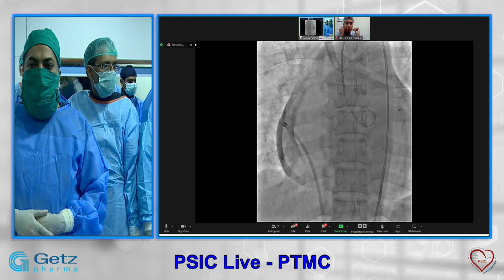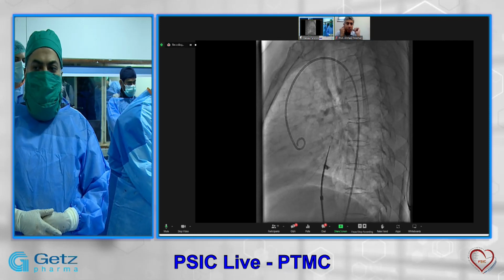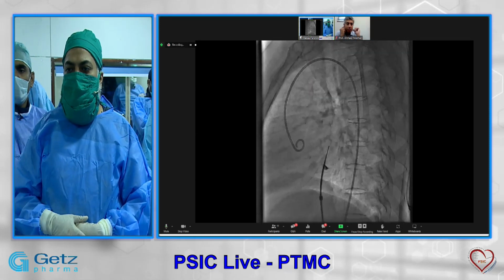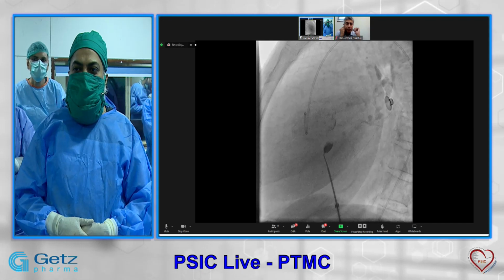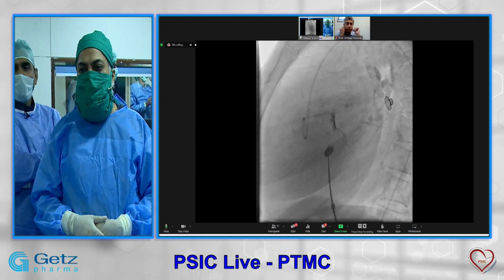Next, please. I think this will probably be the last one because we have got a lot of slides with complications. Next, please. What is this? You punctured, you gave dye, and you found out that you have done a coronary angiogram.